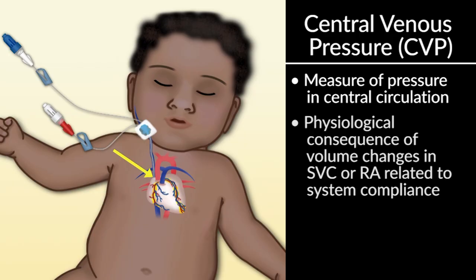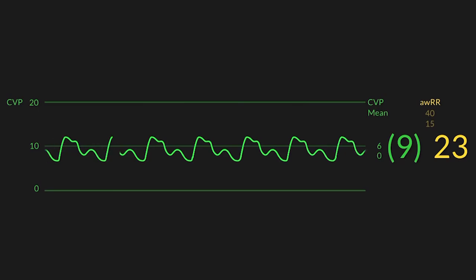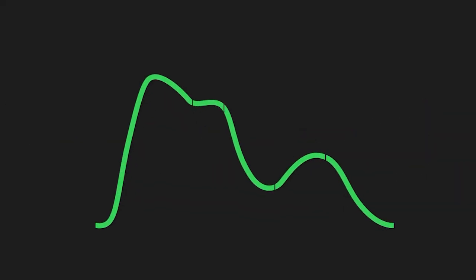What we see here, when we look at a CVP trace, we see a volume moving in and out of the right atrium or the superior vena cava being represented as a pressure here. This pressure, we're going to talk about this trace as one beat of the central venous pressure, and you can see that there's a couple of waves here.